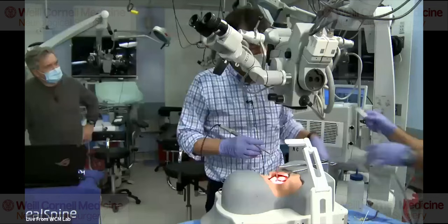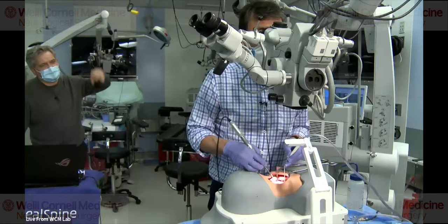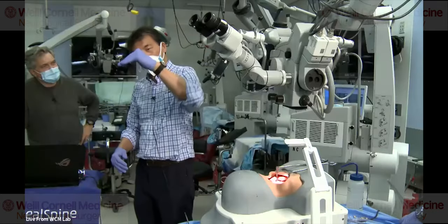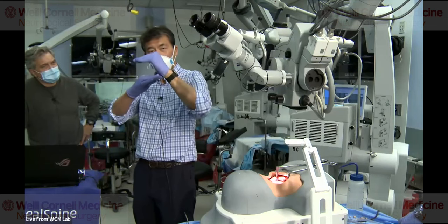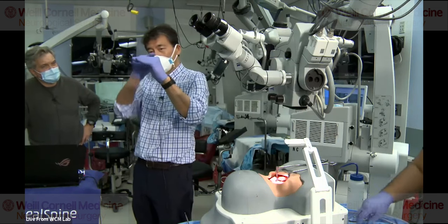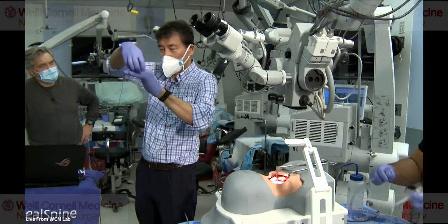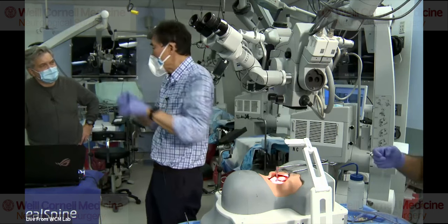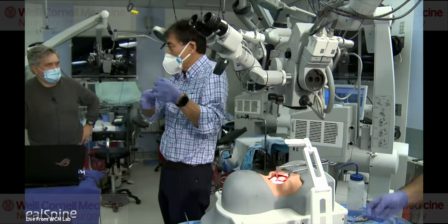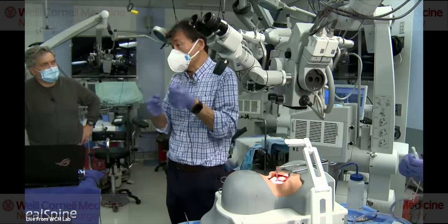So sorry, Lance. What's the advantage of laminoplasty other than the prophylactic? The other thing is that when you do a laminoplasty, you're taking the lamina and lifting it up like that. The lamina that you lifted up is as tall as the spinous process used to be, so the extensor mechanisms can attach to that and help pull the spine back. Whereas if you do a laminectomy, all you got is the muscles attaching to themselves. They get nothing to pull on, so the only place they can pull on is C2.